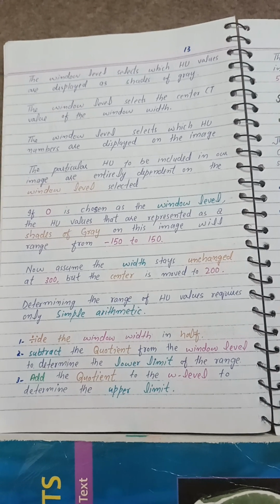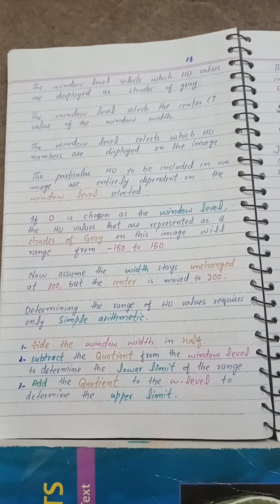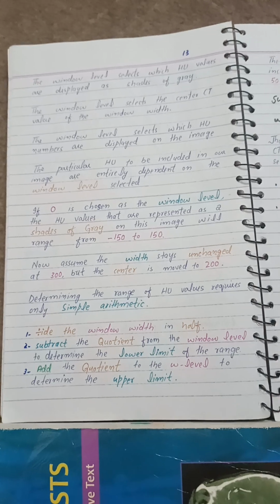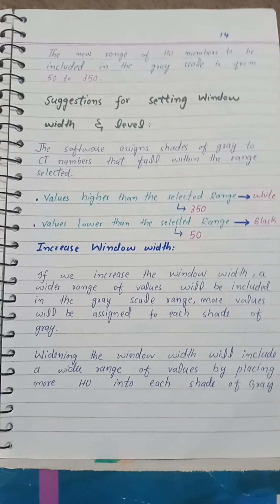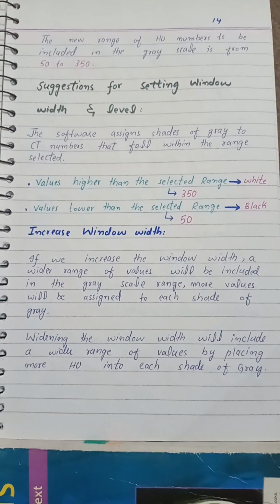Determining the range of Hounsfield unit values requires only simple arithmetic. Divide the window width in half. Subtract the quotient from the window level to determine the lower limit of the range. Add the quotient to the window level to determine the upper limit. The new range of Hounsfield unit numbers to be included in the grayscale is from 50 to 350.